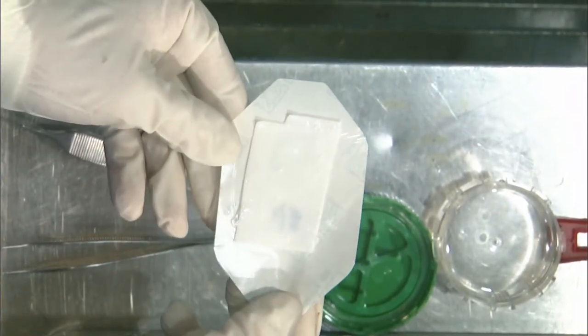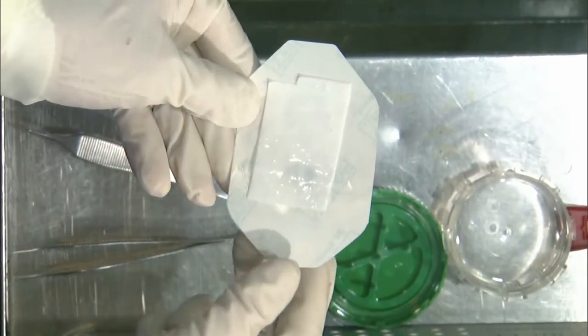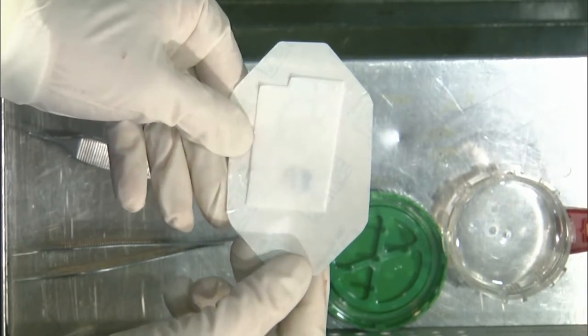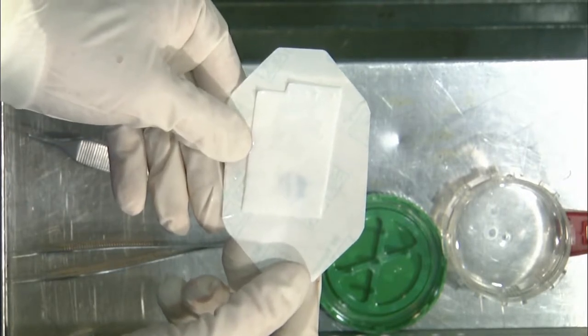So next, what we also know from some studies looking at arthroscopic treatment of defects with MACI implants is that this MACI implant and the cells within it actually do, just like all the other cartilage studies out there, respond to pressure. So in terms of the amount of handling that you do to the actual implant that you're going to put in, you want to try and minimize it as much as possible.